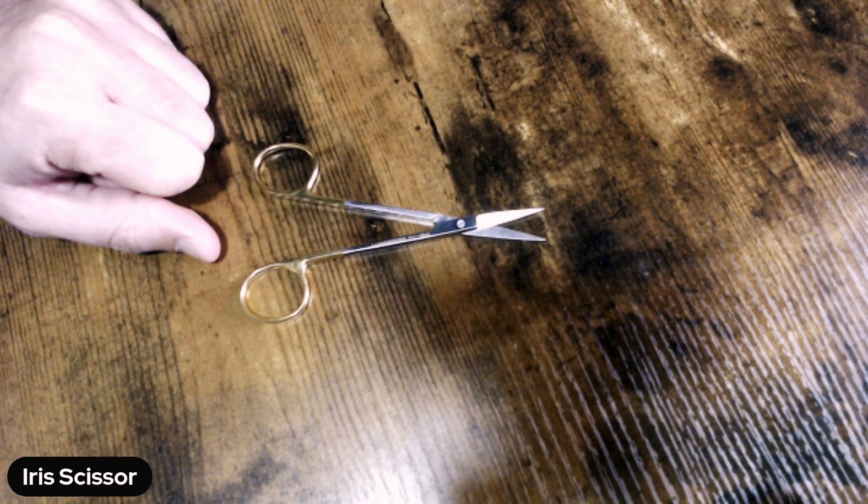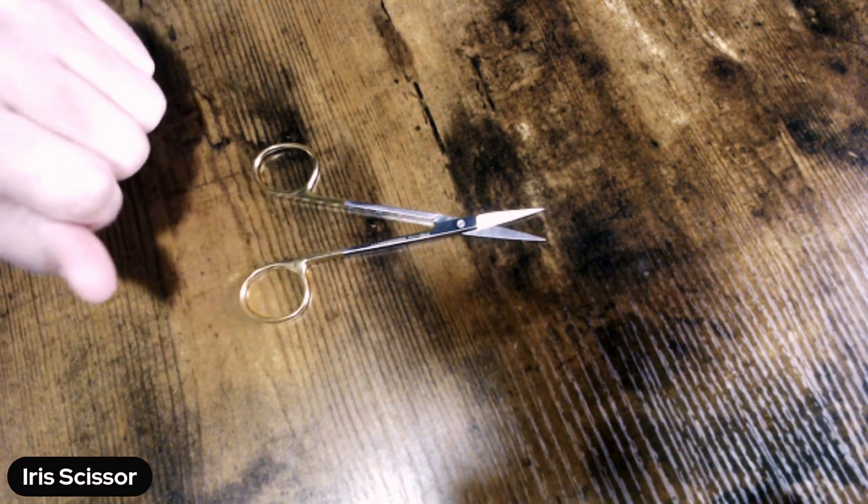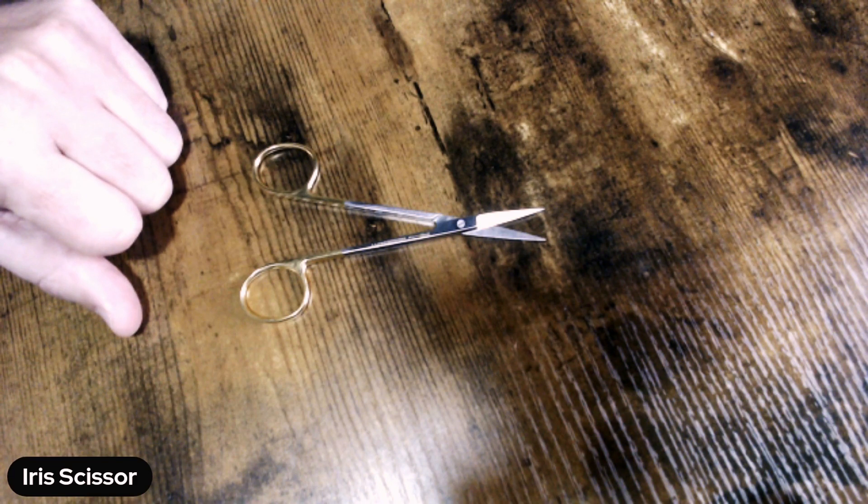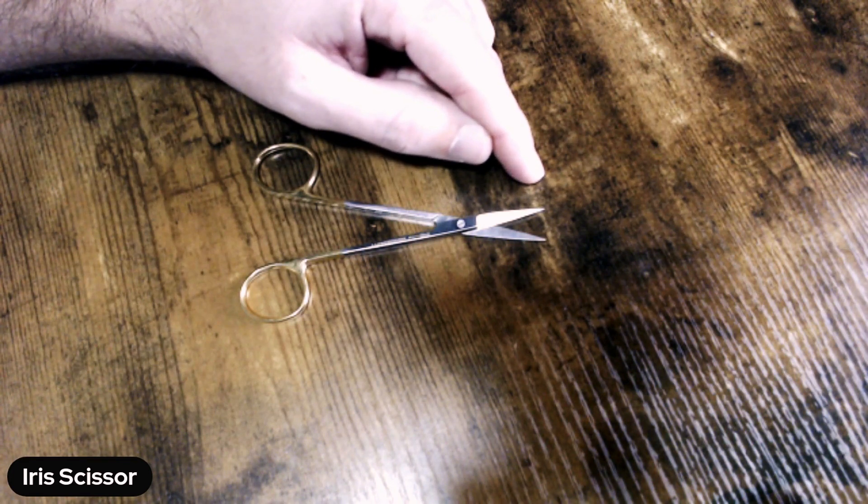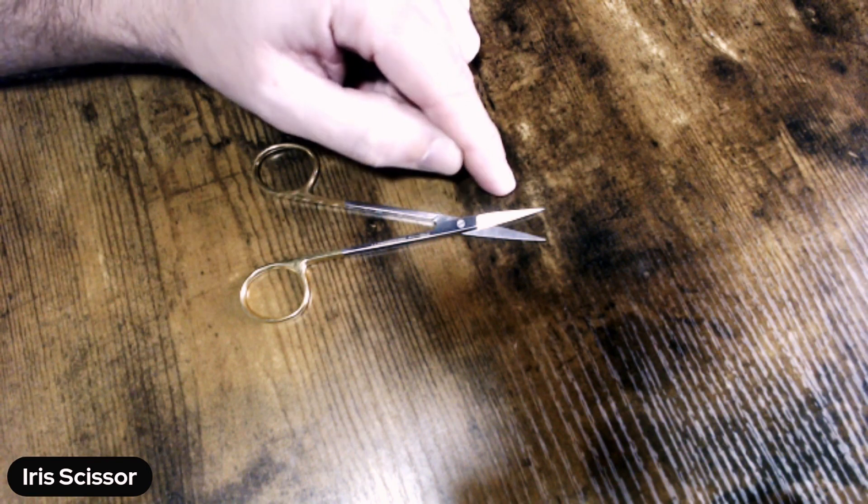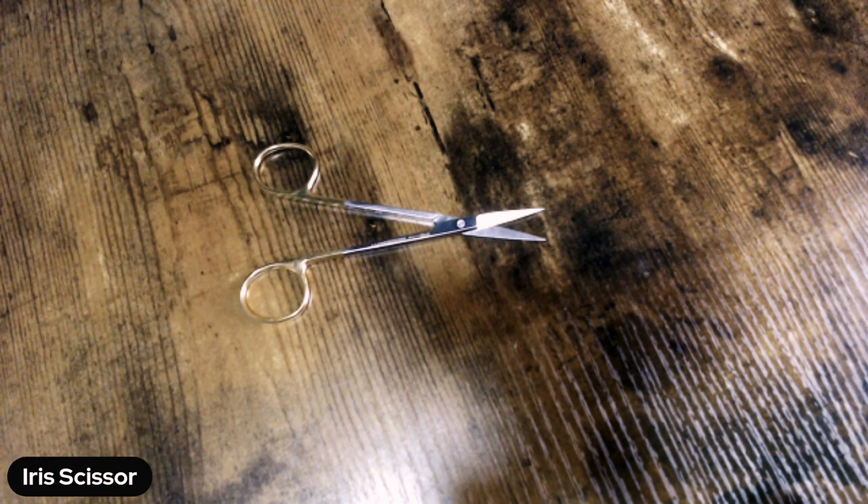However, what's curious about this is the tungsten carbide is actually not on the golden handles itself, even though that's the cue. Oftentimes and almost always, the tungsten carbide is at the working end of the instrument. So in this case of these iris scissors, the tungsten carbide is in the blade. The reason that you place tungsten carbide in the blade is to strengthen that blade, to give it a longer life after it's been sharpened or when it comes first from the manufacturer as a sharp medical device.